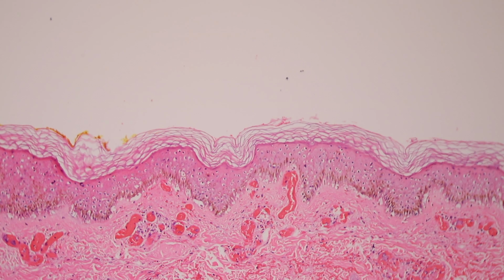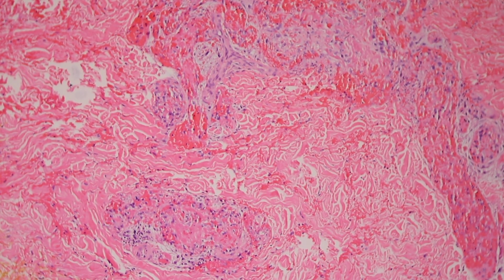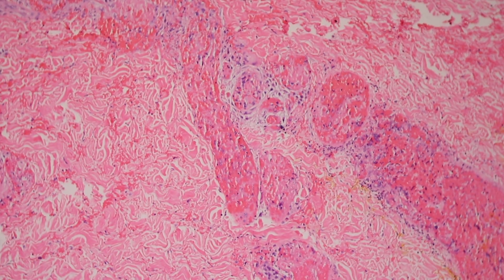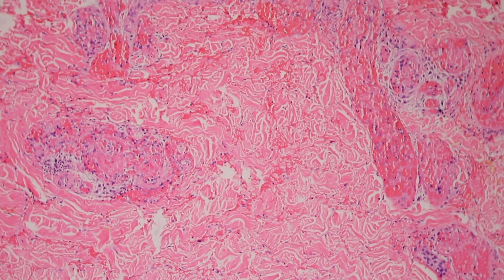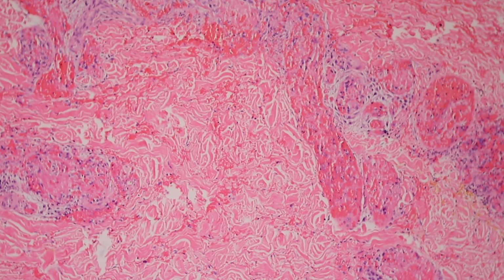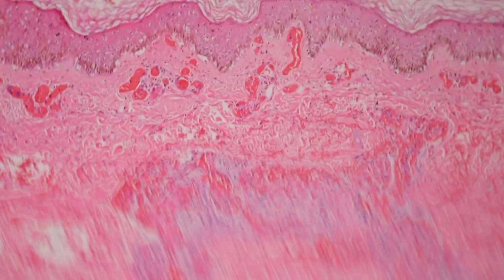So whenever that clinical picture comes up, and when you see this finding microscopically of vasculitis with a bunch of thrombi in them, always think about Levamisole, and the clinical history and a drug screen can be useful to help figure out if that's really what's going on here. If you don't think of it, and they run a C-ANCA and it's positive, it can get confused with other ANCA-associated vasculitis, which often have systemic involvement, and that's not good. So it'd be good to figure out that this is actually drug-related.